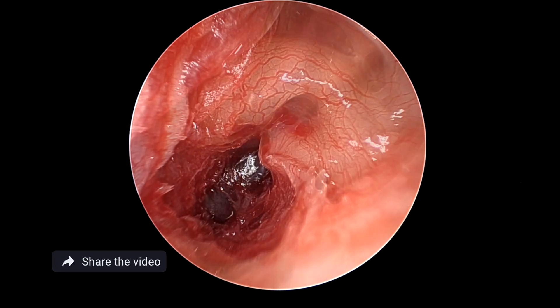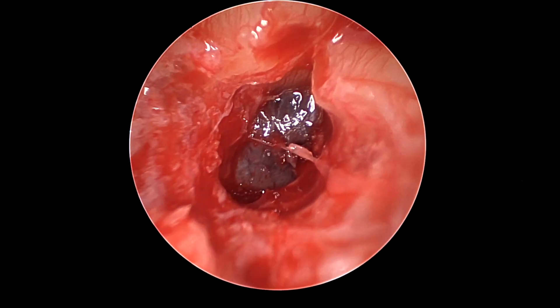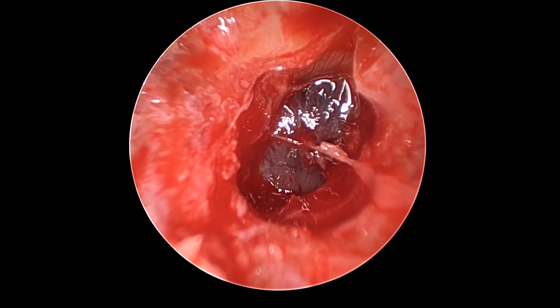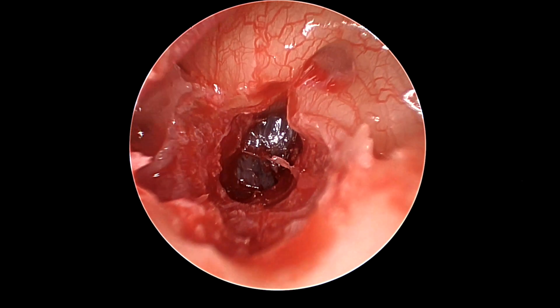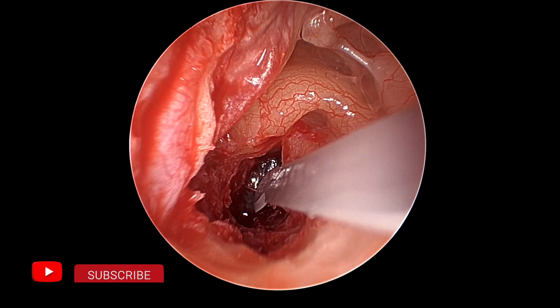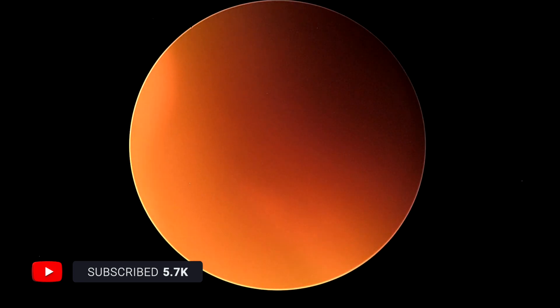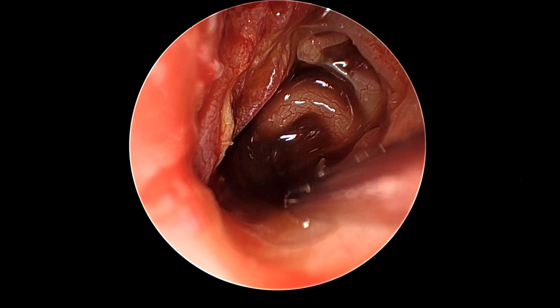Here a magnified view of the opening can be seen. A tympanoplasty blade is then used to open up the cyst and drain out the brown fluid from within, with cholesterol crystals — quite classical of cholesterol granuloma. This can be seen in this image.